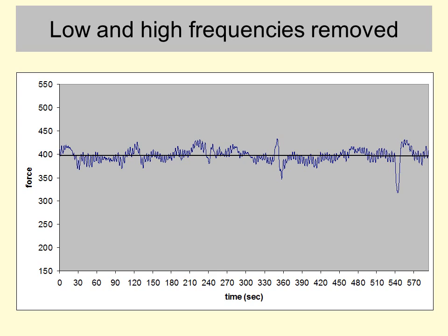And the reason it's really important is because when you fit your model, it's going to account for a certain percentage of variance in the data. But if you leave all that high frequency and low frequency stuff in the data, then the percentage of variance your model can account for is going to be low. And all that other variance is going to go into the error term. So when you come to do your t-test or other statistics, you're likely going to get a non-significant result. If you can reduce the error term by reducing the variance that your model can't account for, you're much more likely to see a significant result.